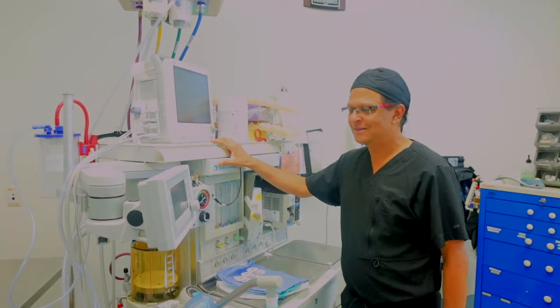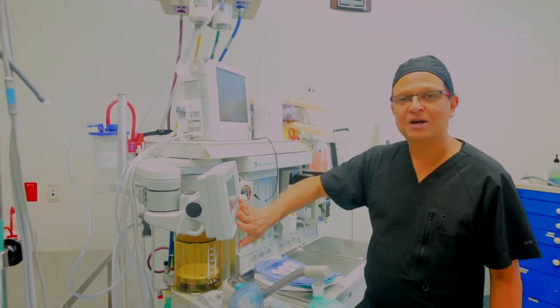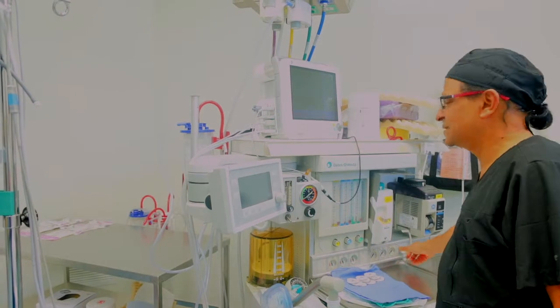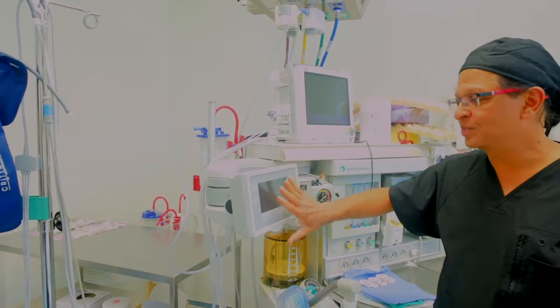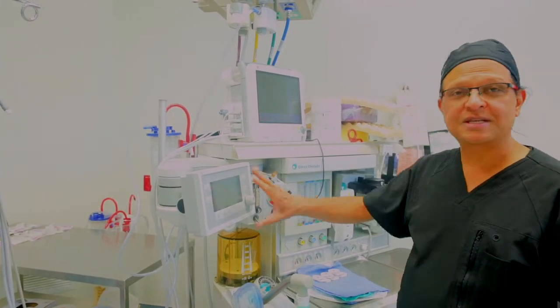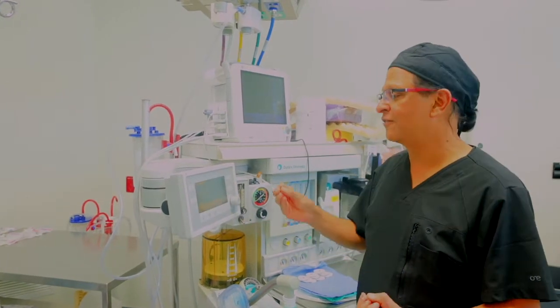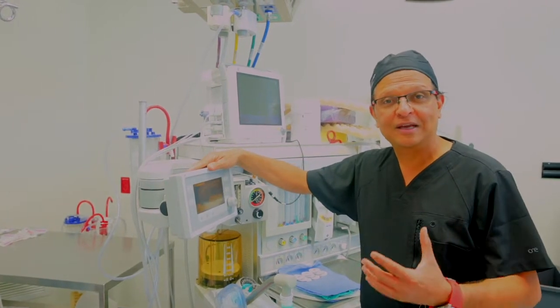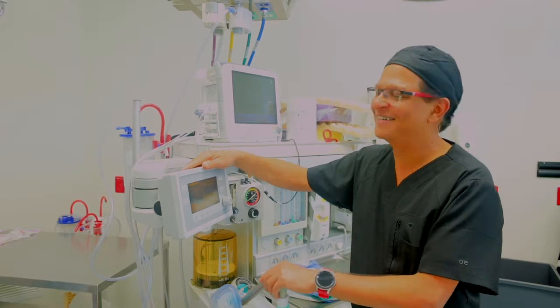And you will also see another piece of monitor here. This monitor will show us how the patient's breathing is going, whether the patient is getting enough oxygen volume, enough tidal volume. This will tell me how many respirations per minute the patient is getting.